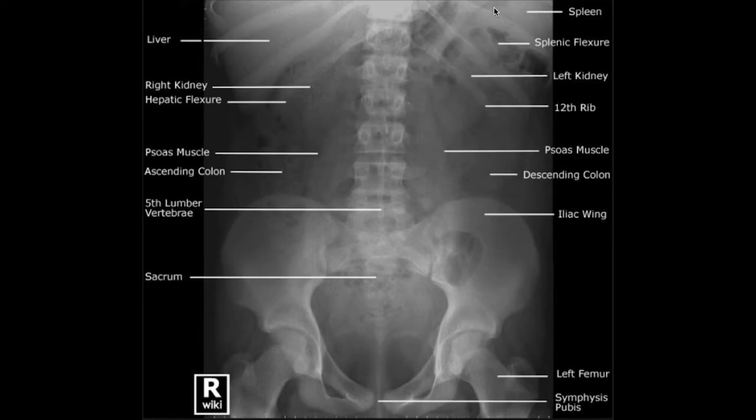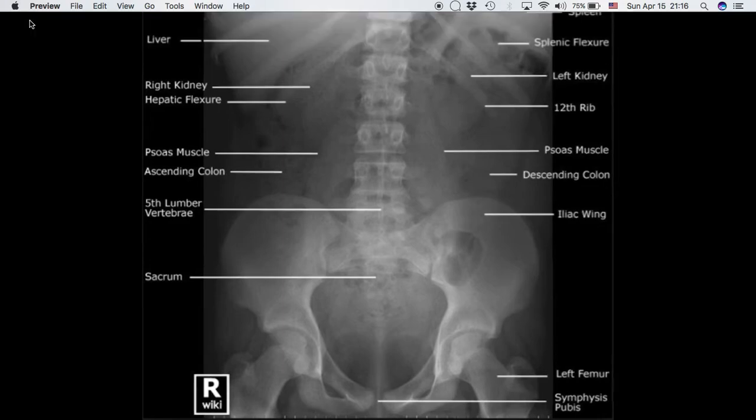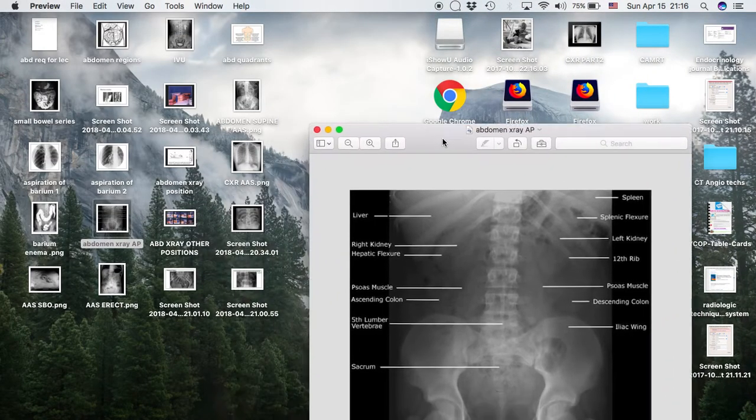Okay, and then we have the spleen up here. You can only see the shadow. Alright, so what's so special about the abdomen x-ray and about the organs of the abdomen x-ray is that in radiology we actually look at subject contrast. Subject contrast is a synonym to the organ density. Now, an example is a chest x-ray. Let me retrieve a chest x-ray to make it easier.